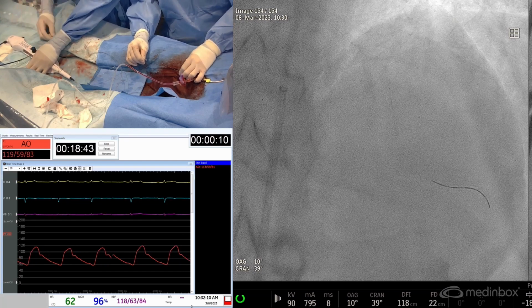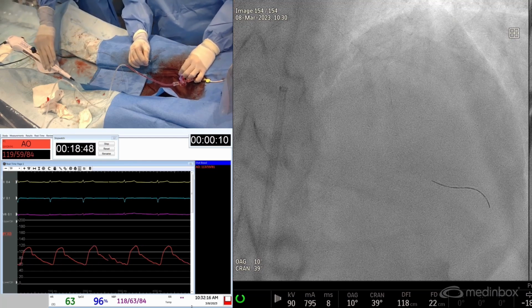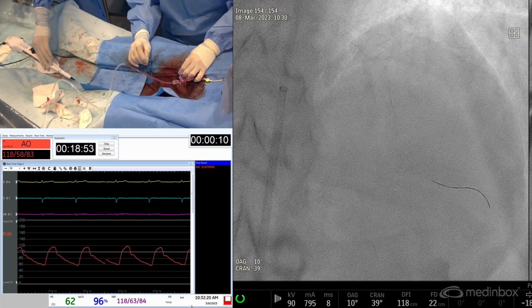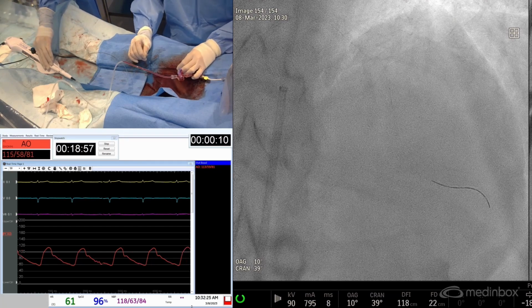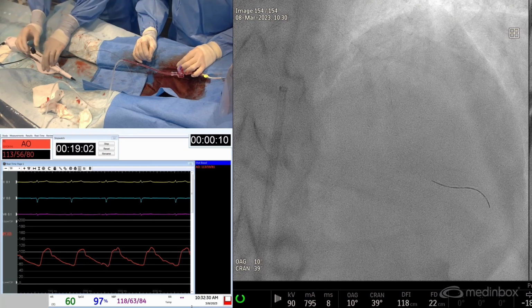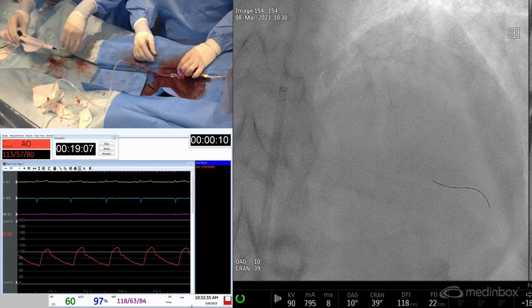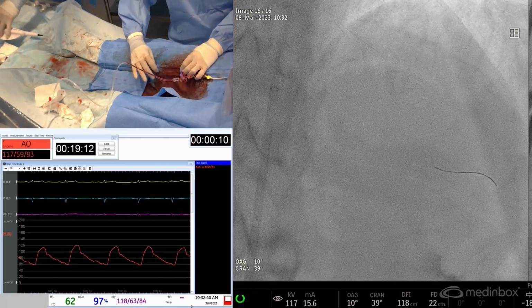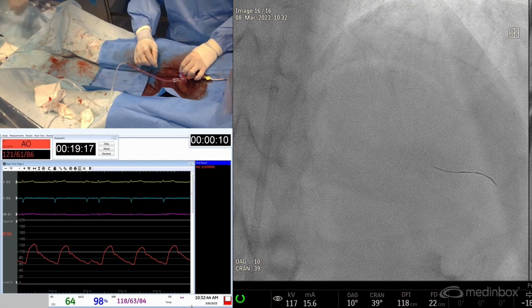So this is a team effort for rotational atherectomy. In this case, just because of the tightness of the lesion, we're going to go very high speed to prevent burr trapping. So we're going to aim for 180,000 RPM. It's always good to check that everything is well connected. Okay, good. So we're starting at higher RPM just because we want to prevent any burr trapping.